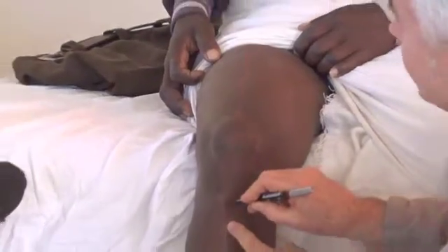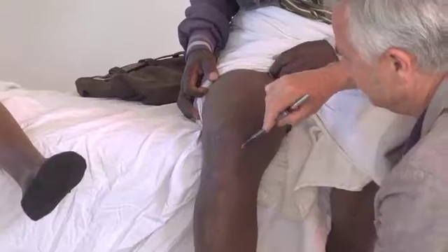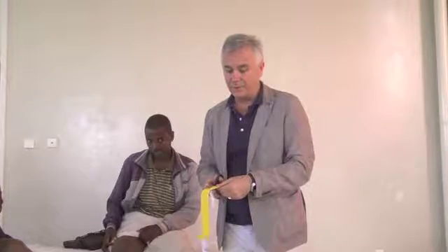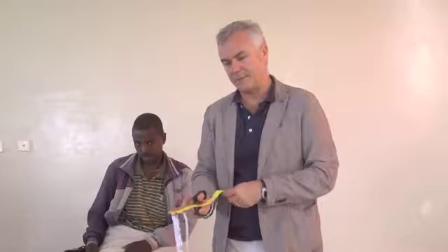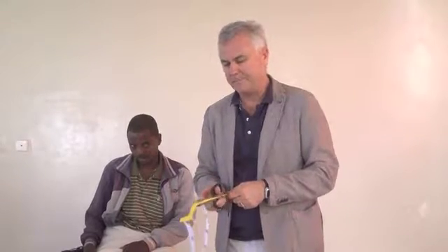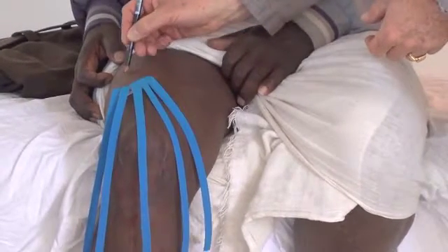And the femoral line, up until the iliac spine. So this is a straight direction. Here you have the crest of the tibia, here you have the tuberosity, and here you have the patella tendon. So you just have to visualize the knee in this way. Some of you need more practice. We only have limited tape available, so you can't throw away tape. I want you to concentrate every time you cut. You lay the tape down and it is one centimeter. One centimeter. Lateral to the medial line.